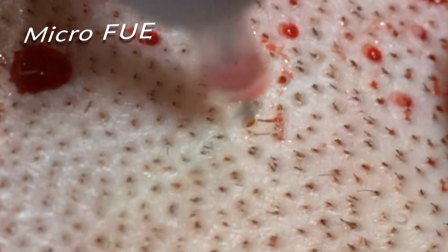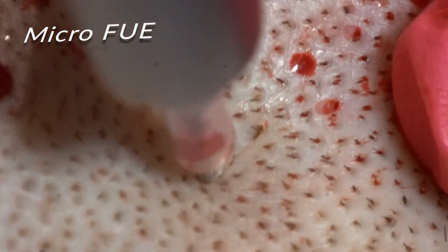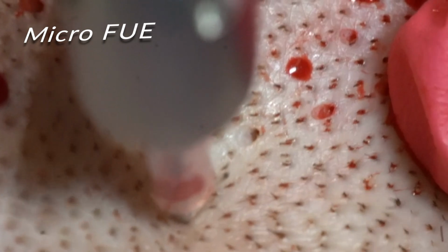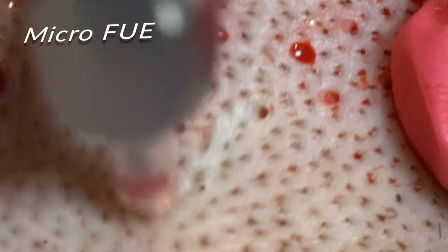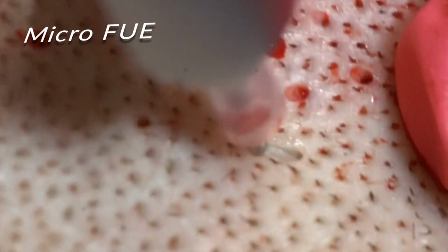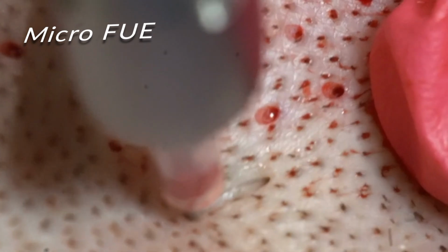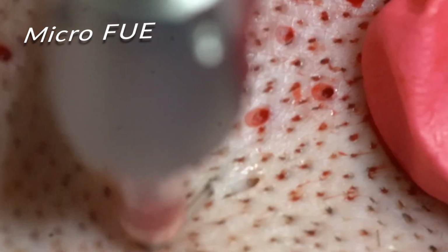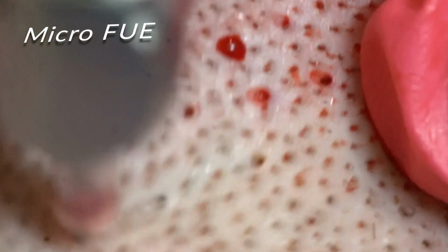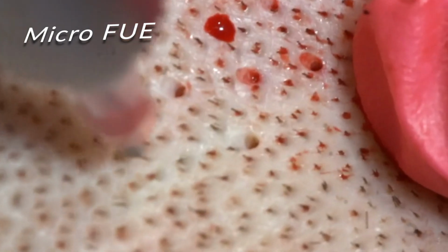Let's go for 2 more. Again, rotation, vibration, suction, and we're going to see another follicle easily delivered, no trauma, using the tweezers. And the last one, for good measure, can we get all 4? And we're seeing the grafts come out, and of course, yep, you see 2 follicles, 4 out of 4 for micro FUE versus 2 out of 4 for the standard FUE.